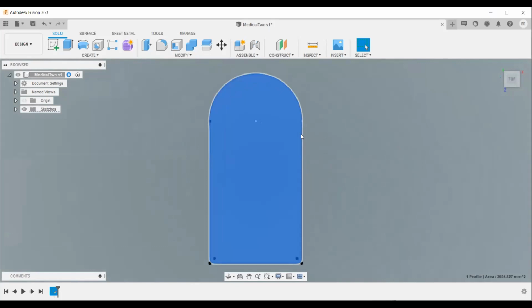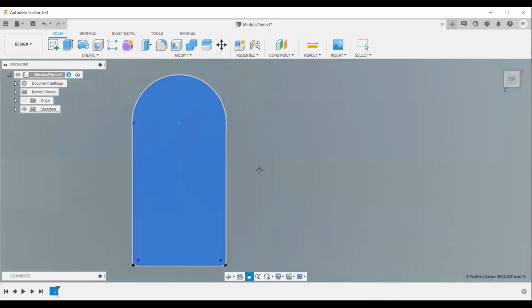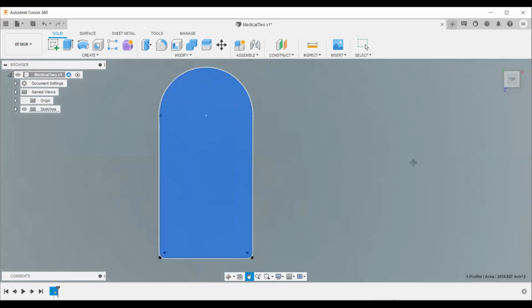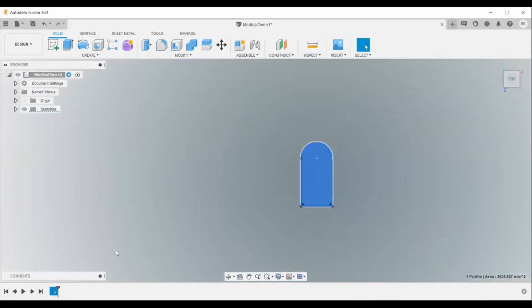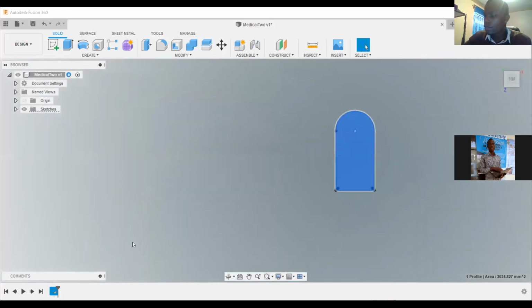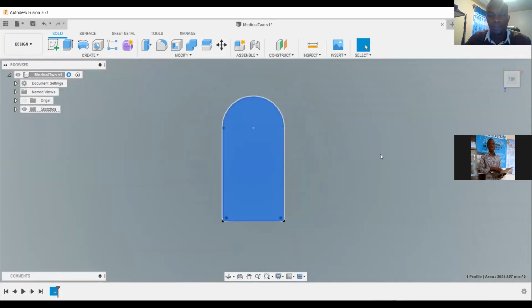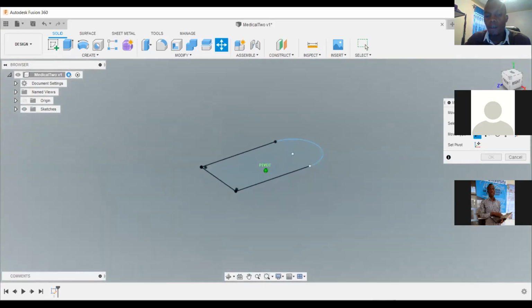And then I want to just highlight a few things to make your work easier in the software. To rotate your part, you have to long press the scroll wheel, then you can move it left, right. You'll be able to pan, to move your part or your drawing left, right. Then when you scroll in and out, it becomes bigger, or you zoom in and zoom out. And if you want to rotate it, the easiest way is to click on the box, and then you can rotate it whichever way you want.